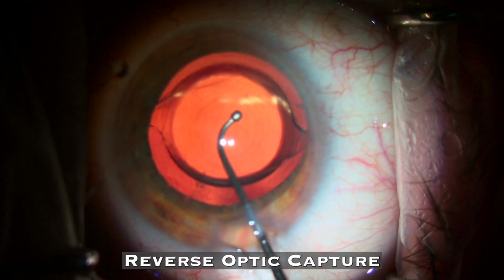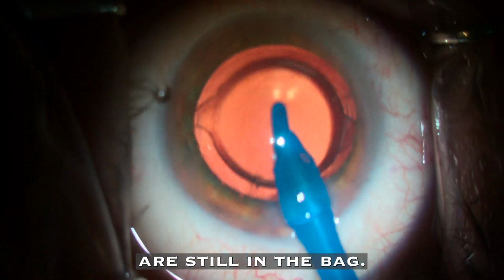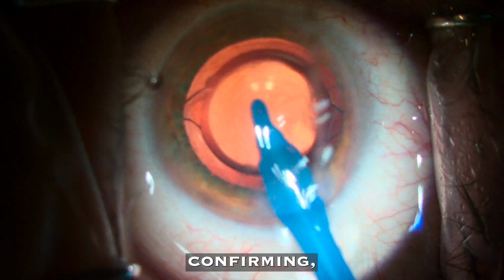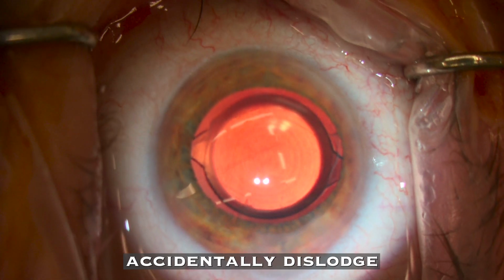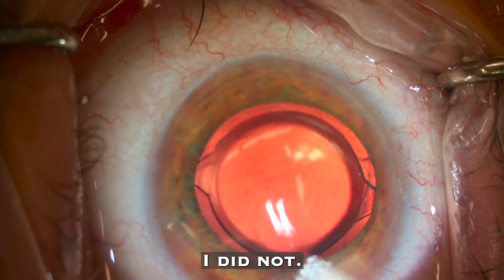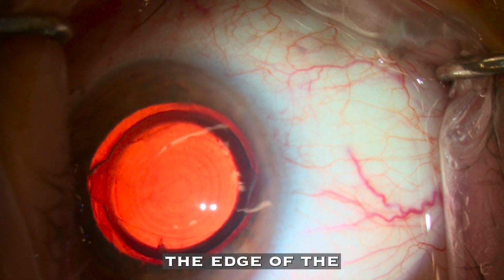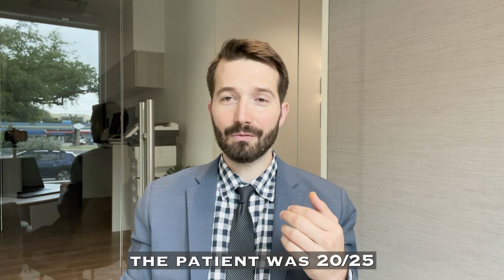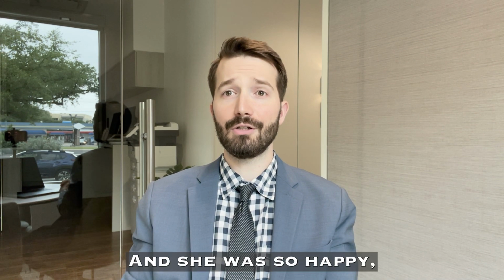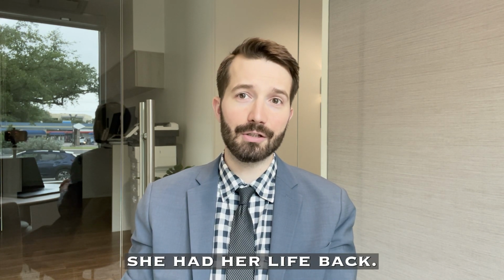I performed reverse optic capture. The optic is in front of the lips of the capsular bag, and the haptics are still in the bag. So right here, I'm just confirming, after I cleaned out the viscoelastic, that I didn't accidentally dislodge or move the lens. I did not. You can see it's sort of subtle, the edge of the anterior capsular rhexis that I made previously. On day 1, the patient was 20/25-ish, 20/30, J1. And she was so happy. The dysphotopsias were already gone and she felt like she had her life back.